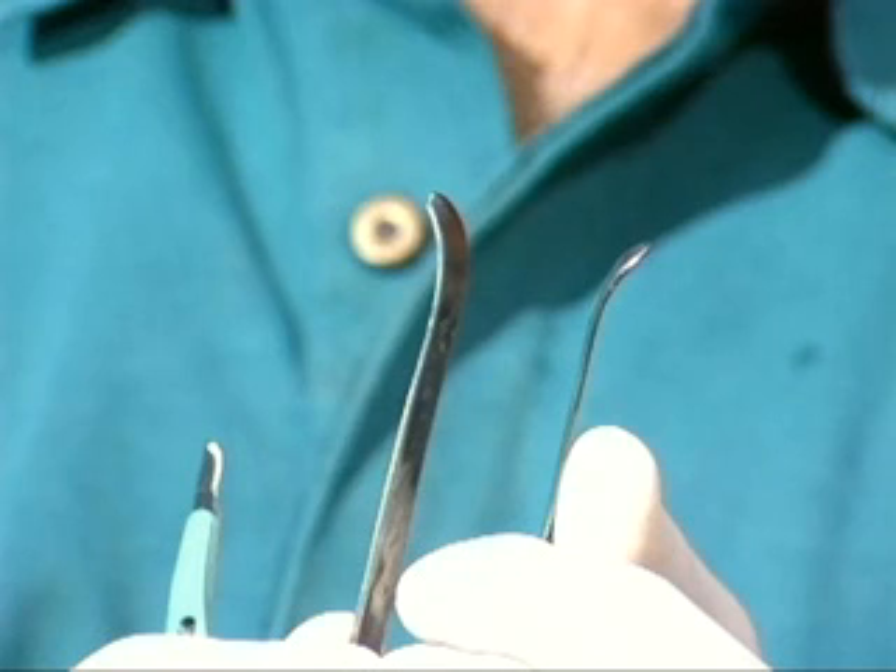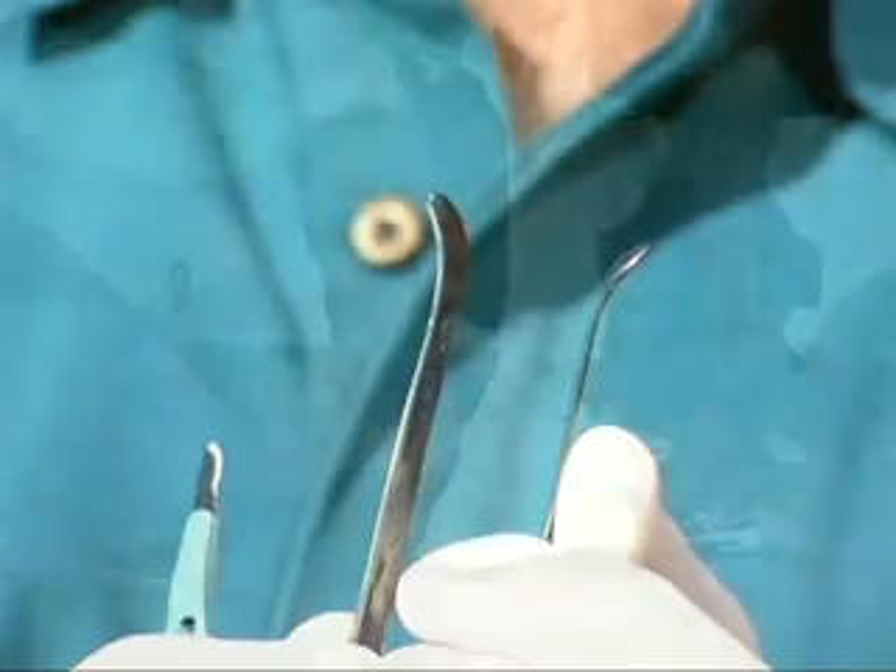You have actually no tension whatsoever on the deep flexor. My retractors are made from stainless steel table knives — you can pick them up at any discount store. Make sure they're of good quality and of one piece. You simply grind them down, shape the ends over a one-inch pipe. Do not heat these — I shape them cold. They're kind of springy, so you have to warm them with a hammer, so to speak. You can make these things up for your veterinarian quite easily. Grind the edges down, polish them on a buffering wheel so they're tissue tolerable, and they become very helpful for this particular technique.